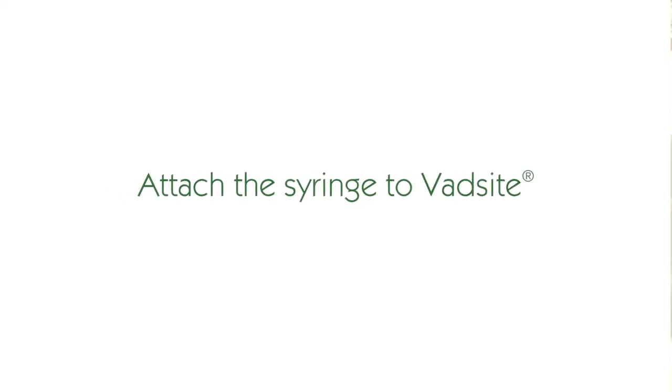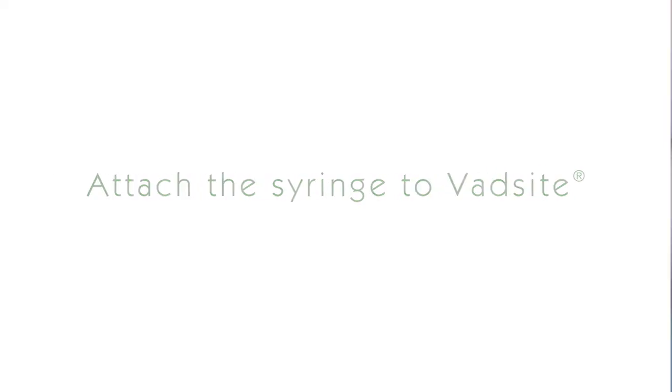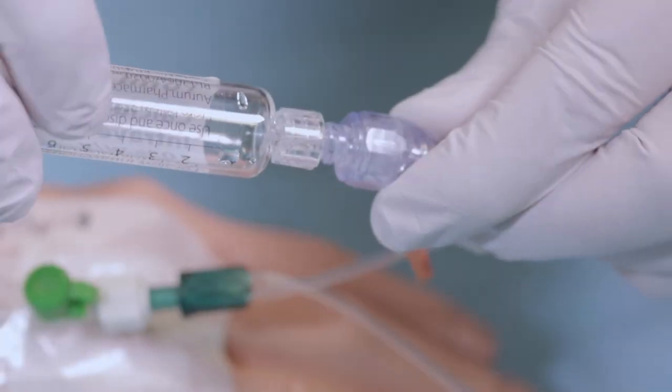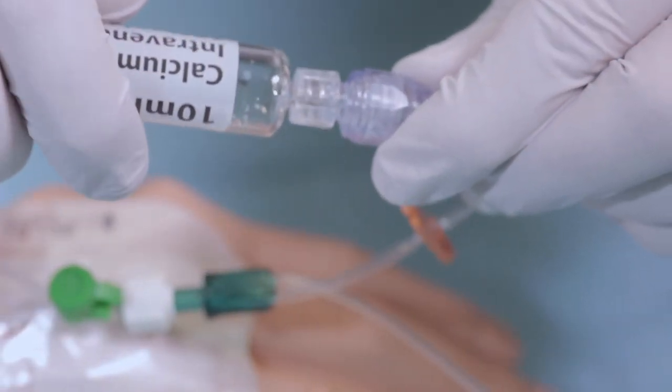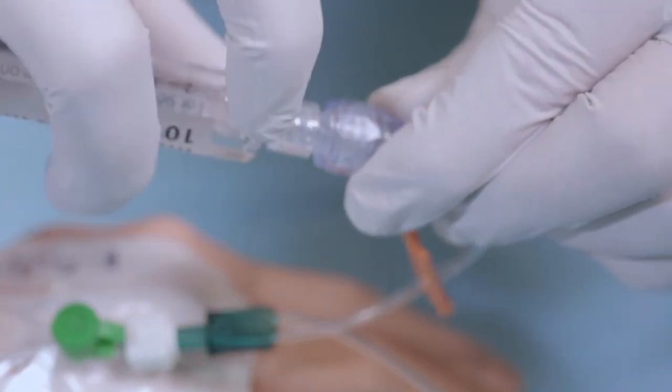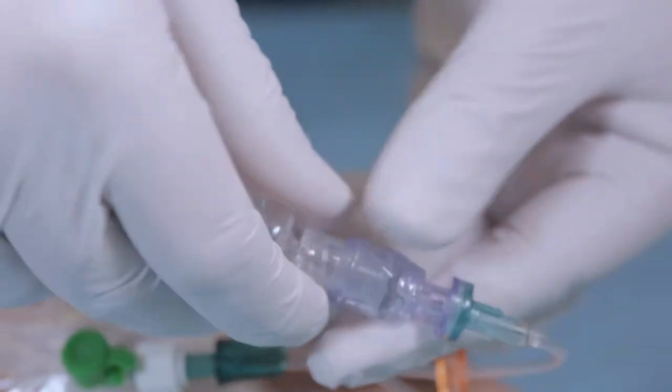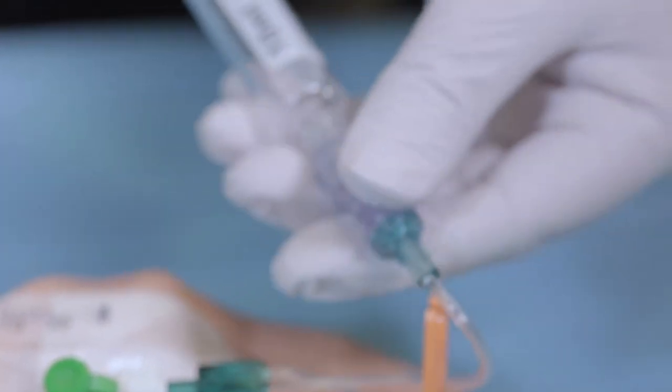Step 3. Attach the syringe to VADSight. Push and twist the syringe clockwise onto the VADSight holding the barrel of the syringe. Ensure the locking collar is hand tight before administering the drug.